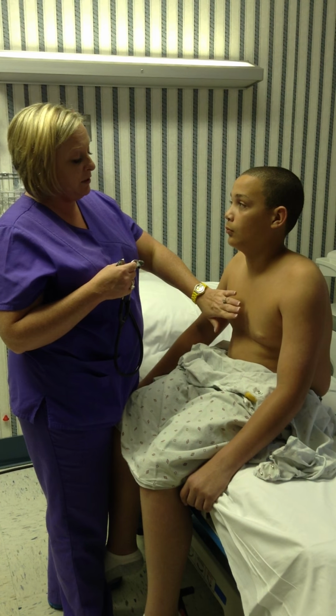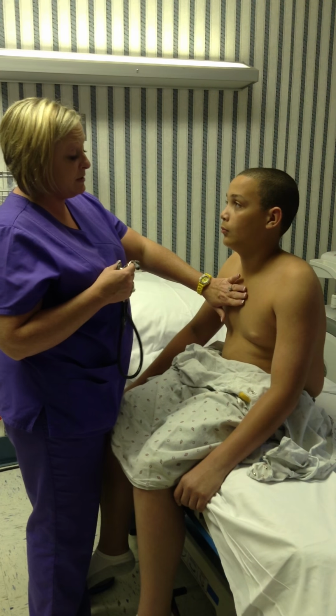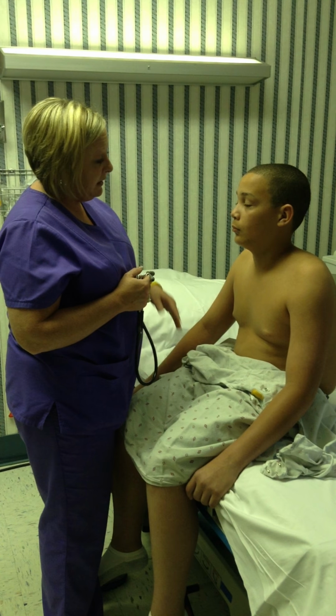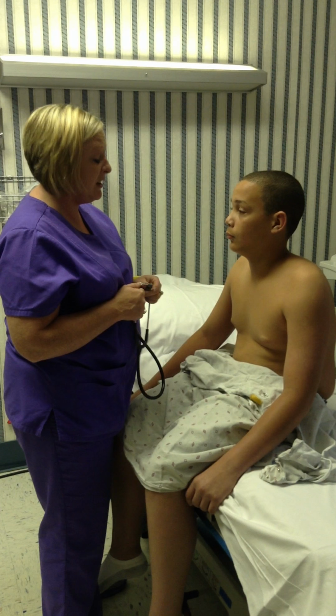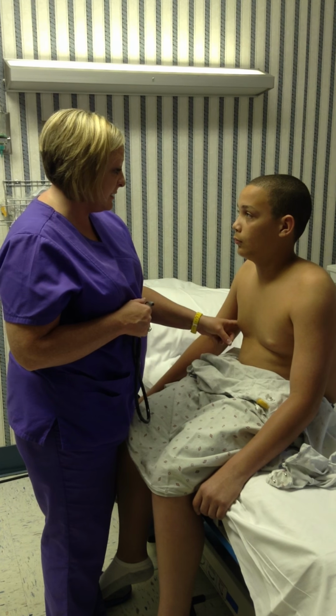And then I'm going to move down to the bronchovesicular. This is this area. They're best heard around the first or second intercostal space. They are medium sounding, medium pitch, and they also have an equal inspiratory and expiratory phase. Then I would move on down to the vesicular lung sounds. These lung sounds are heard most over the lung fields. They have a long inspiratory and a short expiratory phase. So I'm going to go ahead and start off with the bronchial.